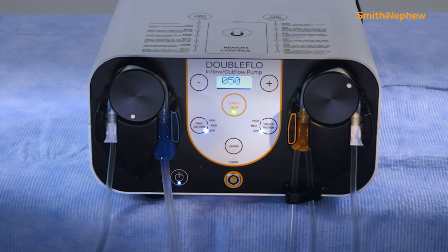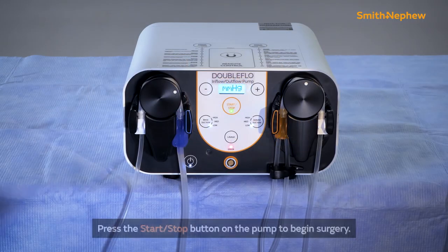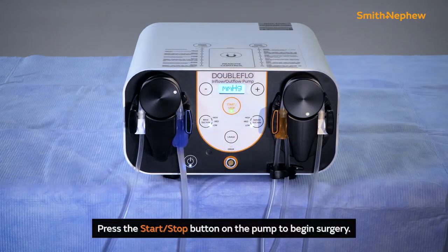Press the start-stop button on the pump to enter standby mode. Press the start-stop button again when ready to begin surgery.